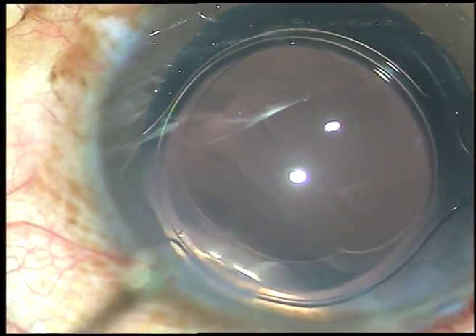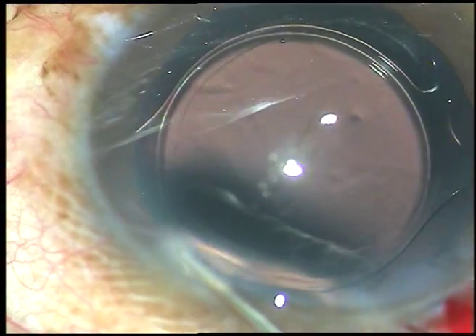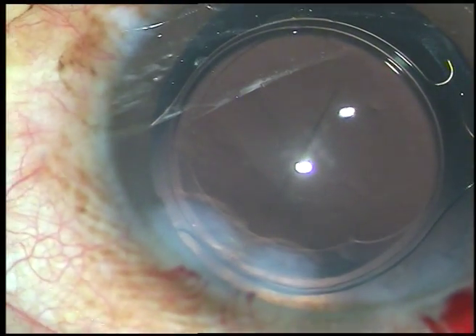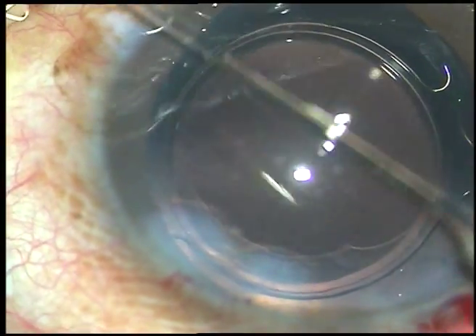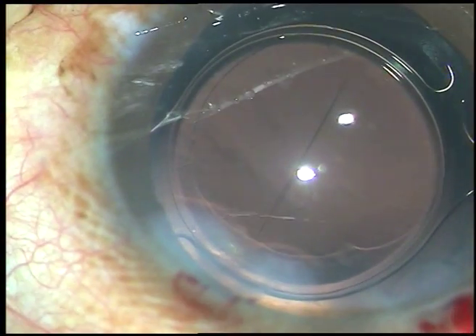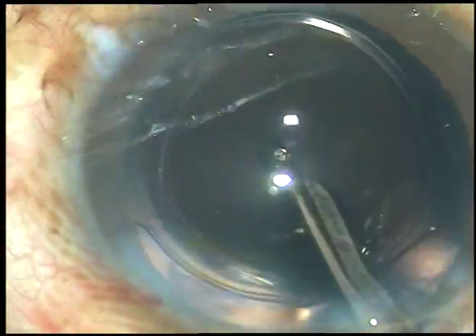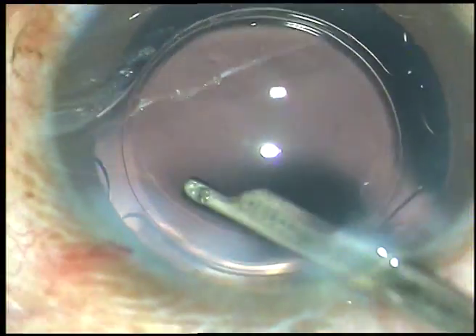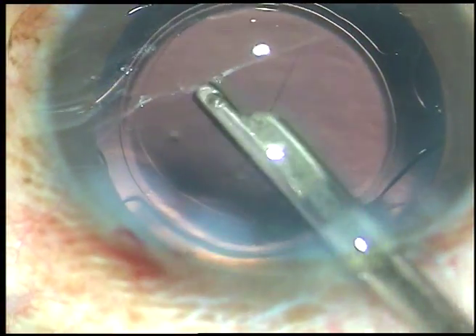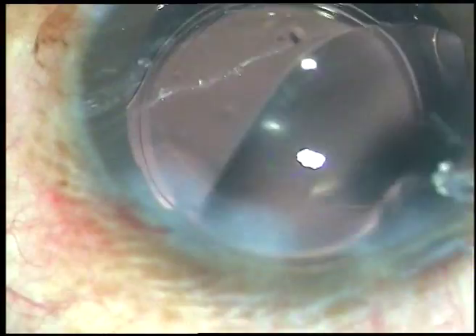The lens is nicely set. A little bit of moxifloxacin is injected. The side ports are hydrated. This is the final lavage of the anterior chamber. This final lavage will remove the viscoelastic substance from the corneal endothelium. Gentle fluid wave will be directed towards the corneal endothelium and it removes the visco from the corneal endothelium. The wound is formed and the case is concluded.